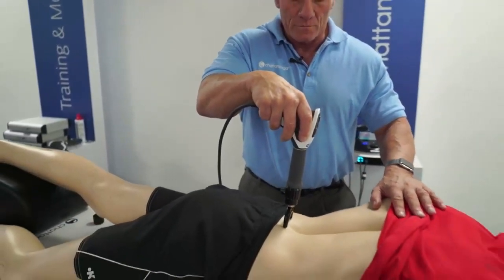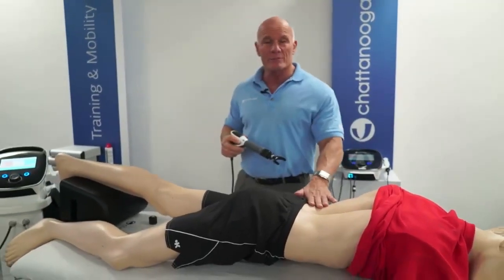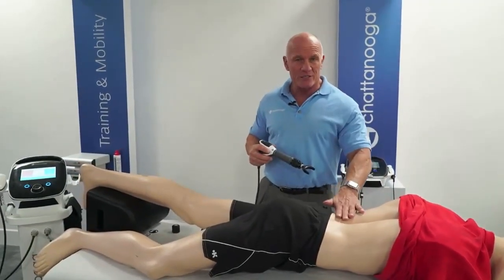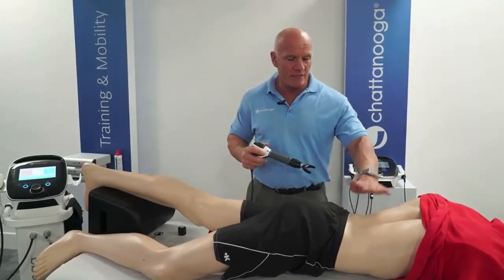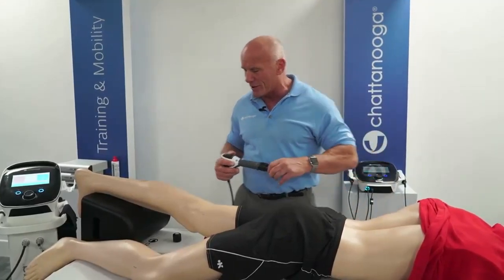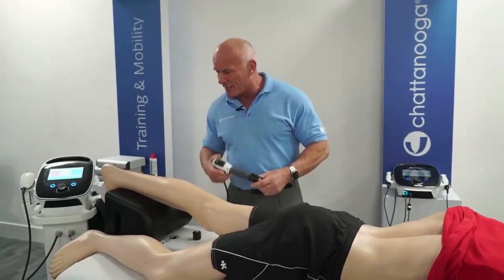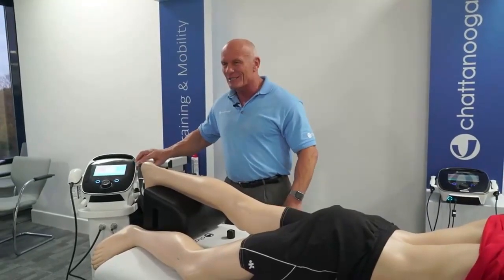Okay? So that completes my treatment of Fred, and he gets up feeling absolutely wonderful, pays me an extraordinarily large sum of money, and we shake hands and part company. Okay, having given him some home exercise. I'm being flippant, but you get my understanding, hopefully.